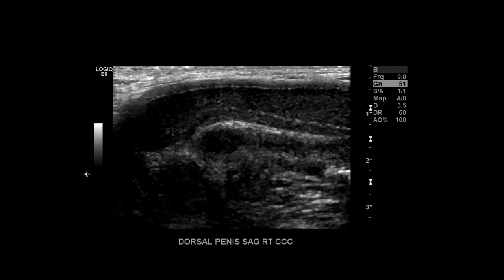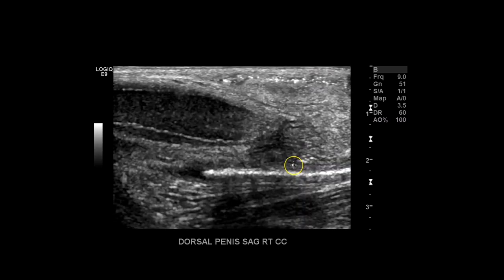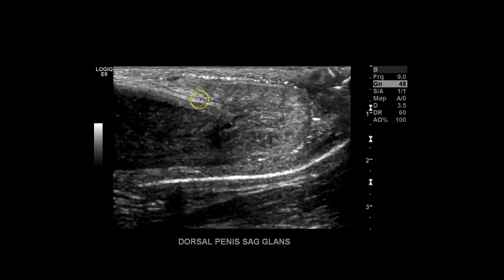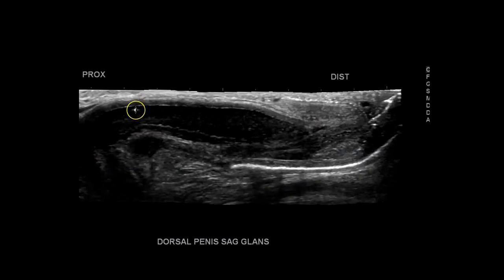Once you're done with the transverse evaluation, do sagittal views of each corpus cavernosum. I begin with the right — dorsal penis sagittal right corpus cavernosum. This is the proximal section and distal is this way. You can see the corpus cavernosum perfectly; the tunica albuginea is intact with no defects. Take a couple images from proximal to distal — it tapers down distally as the corpus cavernosum connects to the glans. Here you can see the beginning of the glans, and finally the full glans. There's still foreskin over it.